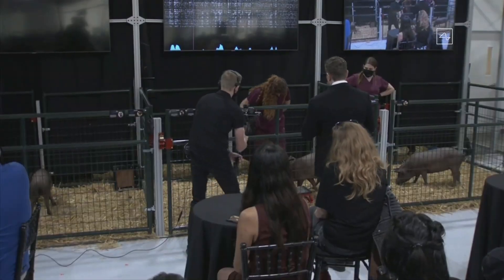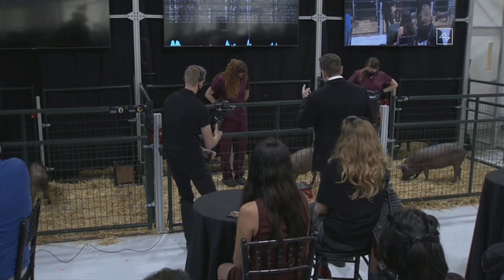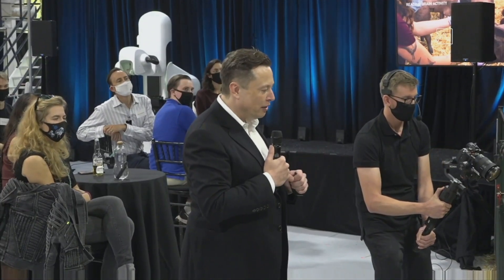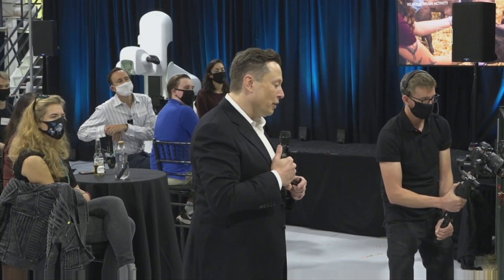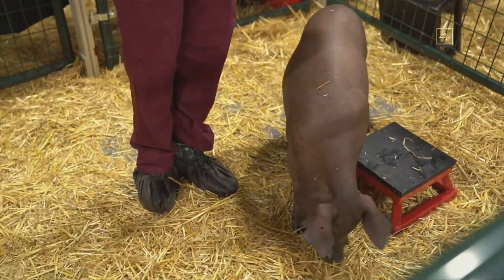As you can see, we have a healthy and happy pig — initially shy, but obviously high-energy and kind of loving life. She's had the implant for two months. So this is a healthy and happy pig with an implant that is two months old and working well.